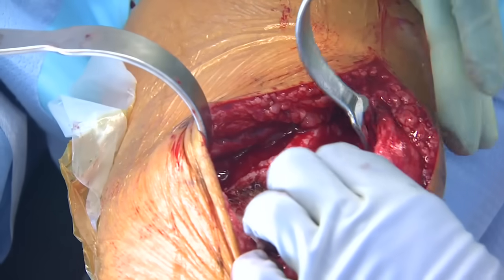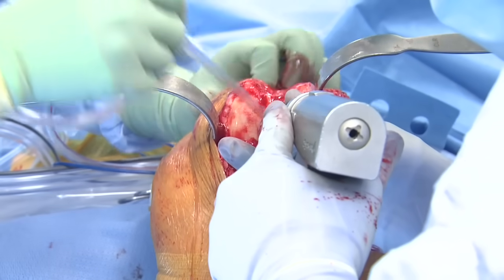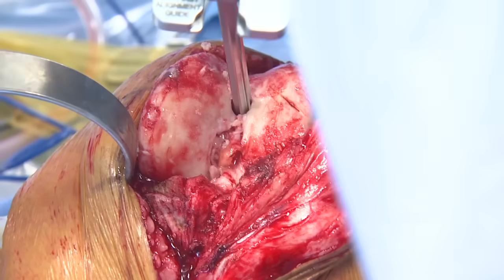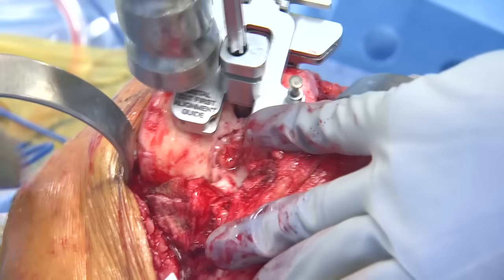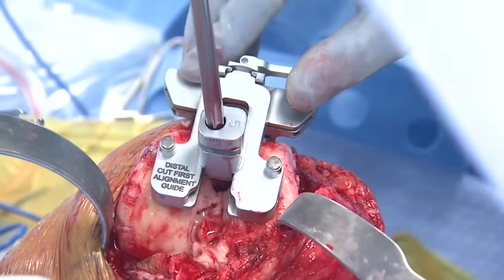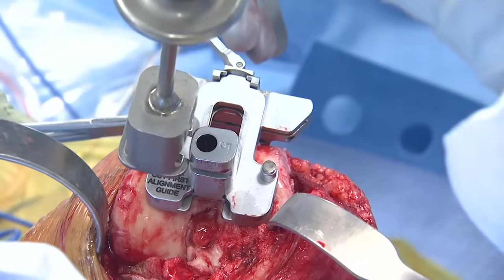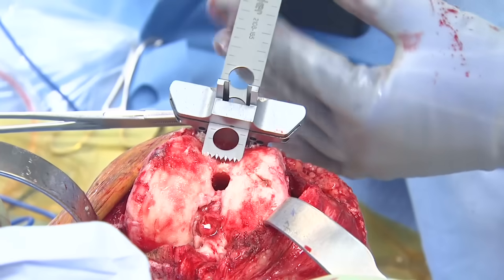The distal femur is visualized in its entirety. After access to the medullary canal is made, the distal femoral cutting guide is placed. The distal femoral cut is then made.